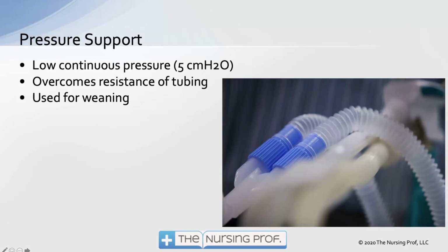Pressure support is something else you may hear about. Pressure support is something we plug into the ventilator that just helps the patient overcome the resistance of the tubing. Breathing through ventilator tubing is similar to trying to breathe through a straw. So if you were to take a straw and just put it in your mouth and breathe through that straw while you walk up a couple flights of stairs, you're going to find that it gets really difficult to breathe, because that straw limits the amount of air that's going in and out. There's a lot of resistance in that narrow tubing, right?